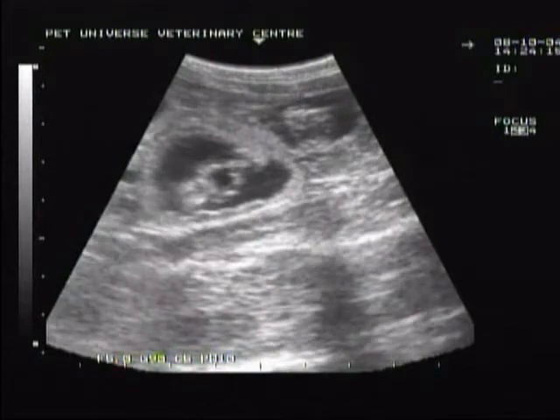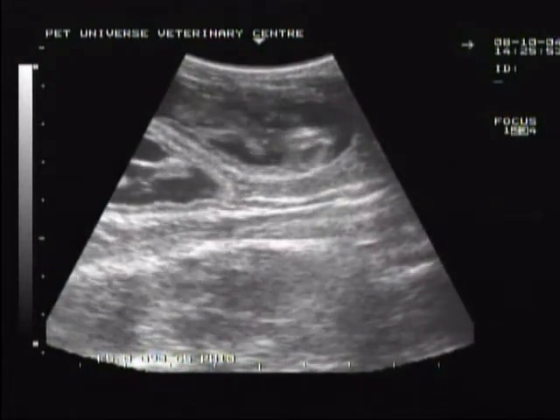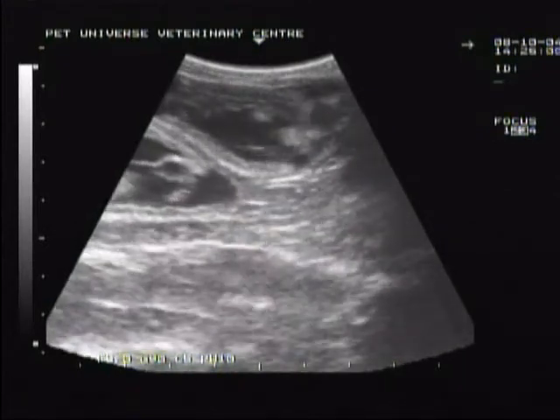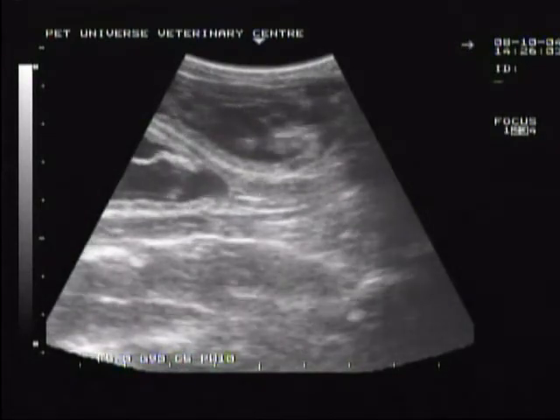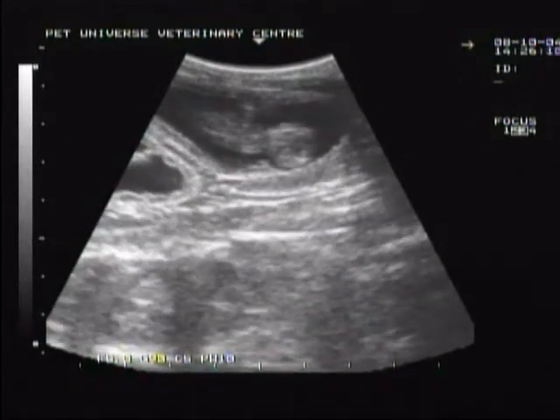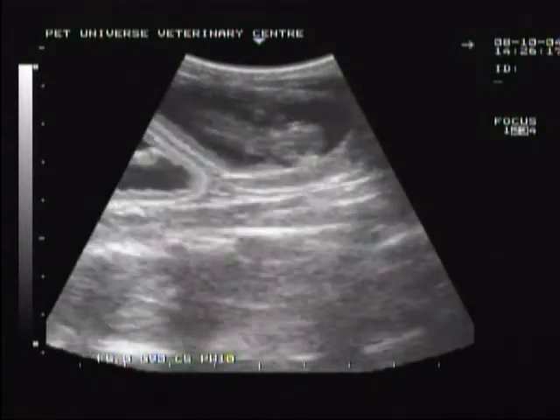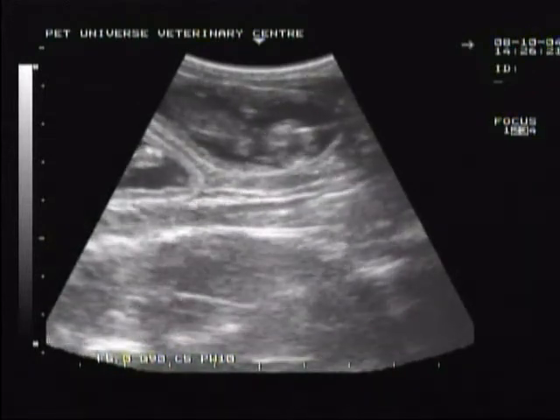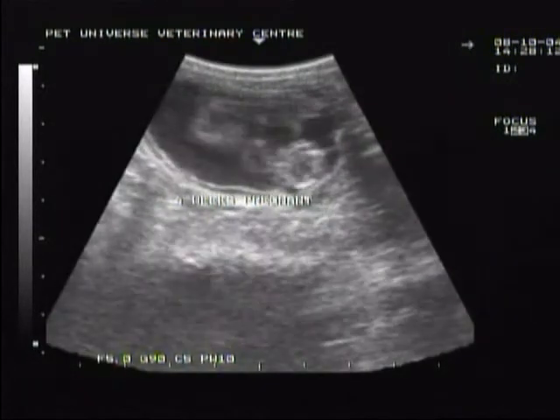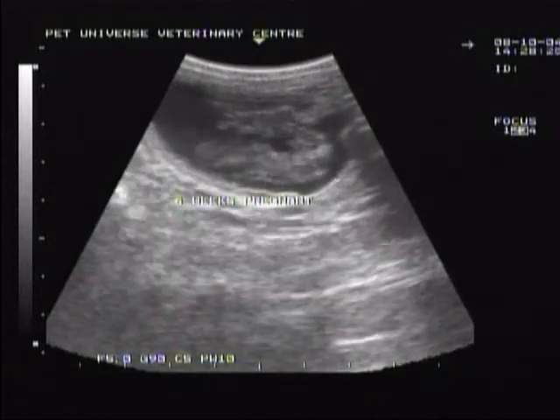Let's try to zoom into one and see if we can get one that kicks around a little bit. Here we go. Here's a very active little baby, head pointing towards the right. And you can see we're turning around, feet are pointing towards us now. And there we go. So that's a nice active baby there. Very healthy indeed. Still twisting around some more. Here we go. We're doing some baby aerobics there. You can see the umbilical cord on top coming down to the fetus, the head on the right. Wonderful shot.